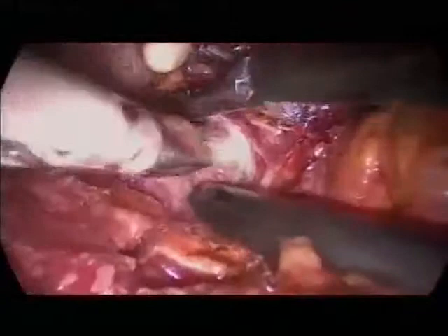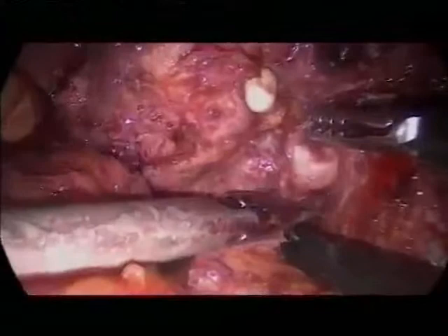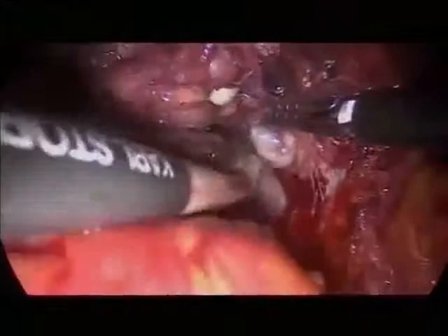But you see, this is what I mean. You are not directly coming to the... Now it's the vas. This is the vas deferens. This is the vas. And as soon as you have seen it, you can use blunt dissection to free it a little bit more. Now it's easy to see on both sides.